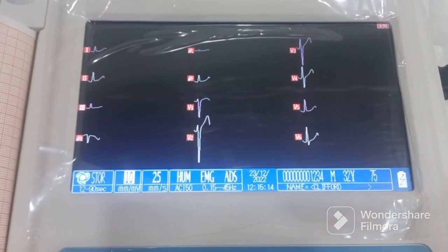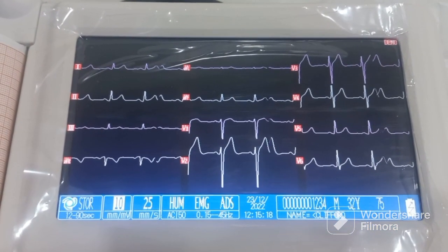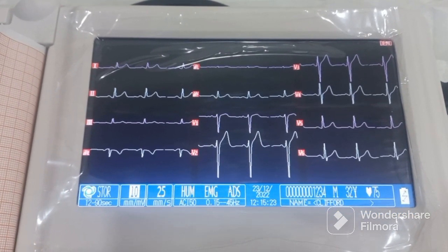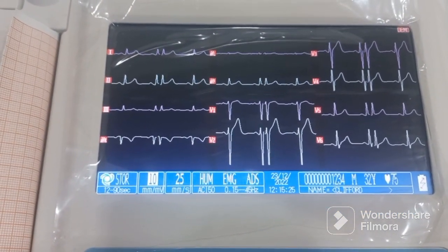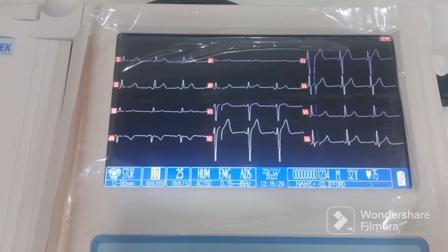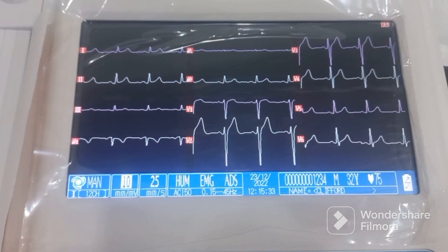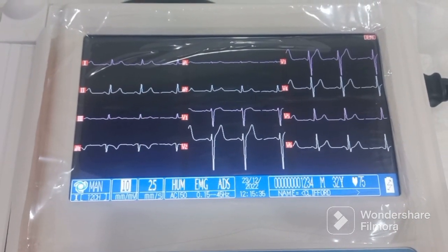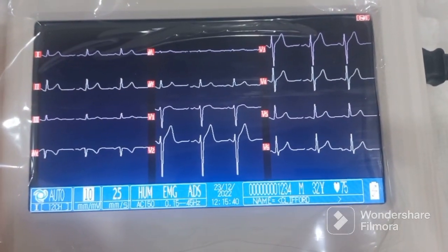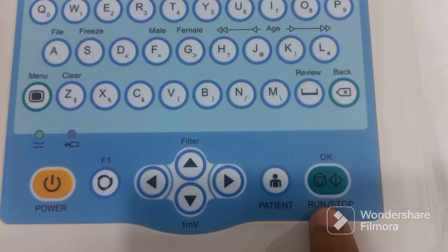The second mode is the RR mode, the histogram mode. The third is the store mode — in this mode there is no ECG printing; it directly stores the ECG. Whenever you take a print, the ECG is automatically saved since the machine has storage for 250 ECGs. The fourth is the manual mode, which is used for a long lead print.